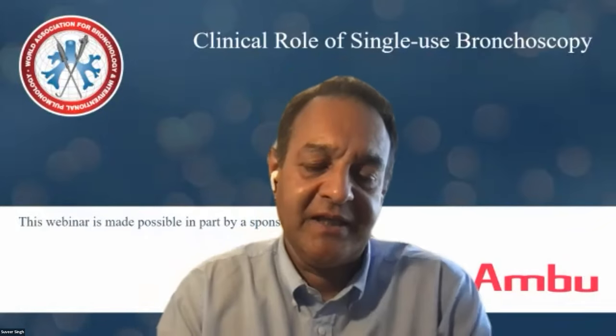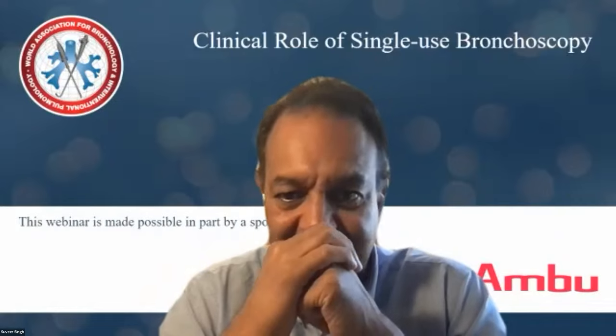I don't know if Sonali and Jonathan would like to make comments on that, because it's a really important point. I'm in agreement with you. Everything I read in the literature is appropriate to what you were saying. The scopes tend to sit out for a while and they get a lot of biofilm. And although we may think we're doing a good job, like I showed you, of cleaning scopes, we really aren't. And I would be very wary of using a single-use scope in another patient as well. And in fact, the recommendation is not to even use the same scope in the same patient hours later. Correct. Or the next day. It is truly single use that one time and then to get rid of it.